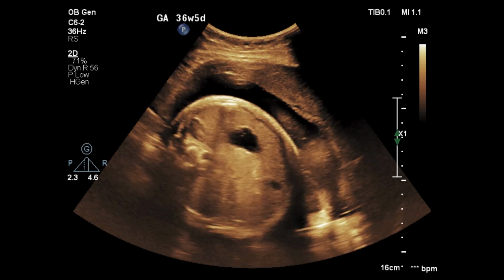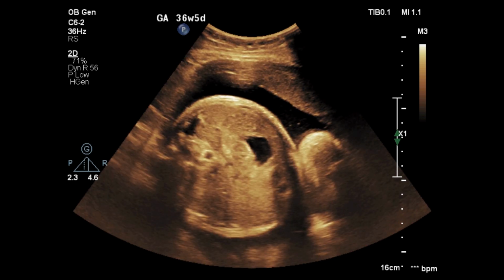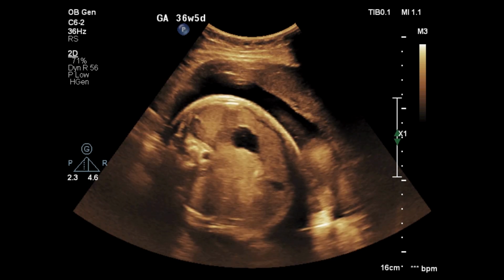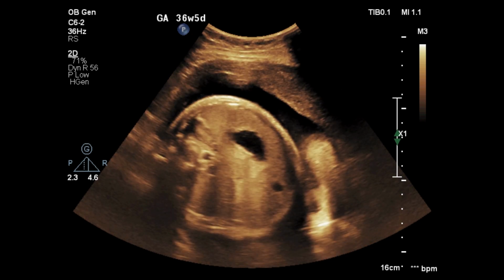Here in cross-section of the fetal abdomen, you can see the outward-inward movements of the abdominal wall due to fetal breathing. We need at least one episode of these movements lasting at least 30 seconds within the observation period to give the fetus a 2 score.